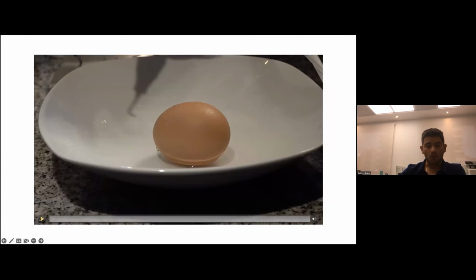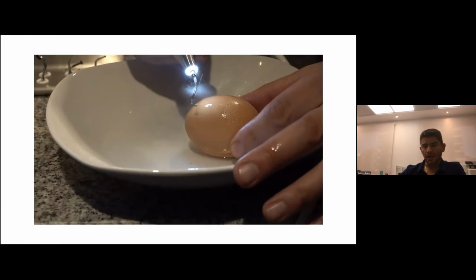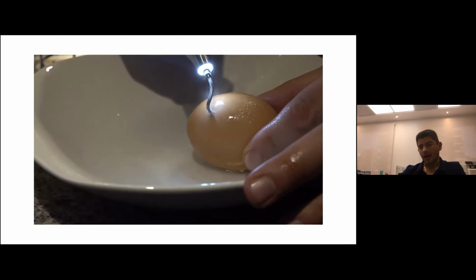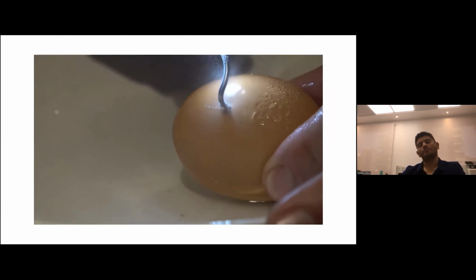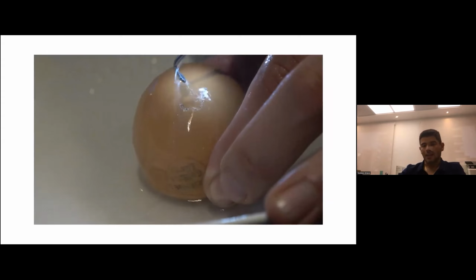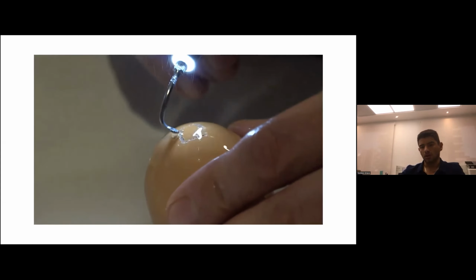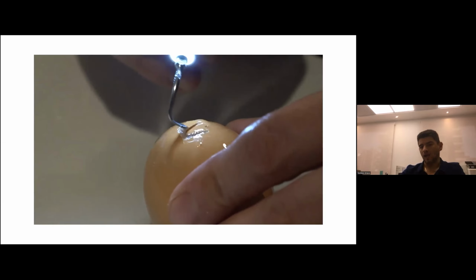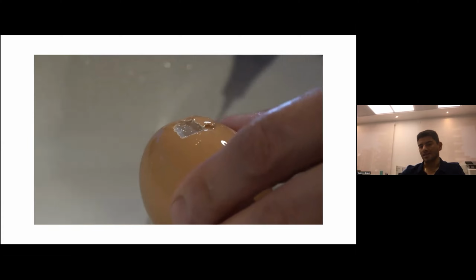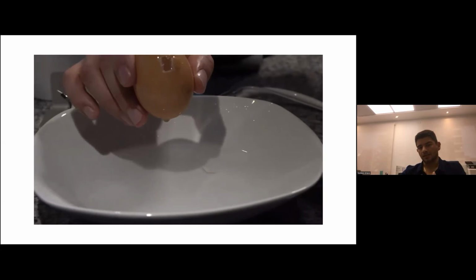Here we can see a home video that I did with an egg. This is in Spanish, but I will introduce it. We can see how we cut the cap of the egg without breaking the inside contents, so we can see that it's very precise. It has the irrigation system, and we can cut the cap of the egg very precisely without injuring the other tissues. Here we can see how we extract the cap, and the inside layer is intact. It's really, really precise, and it's a very good instrument to cut the bone.